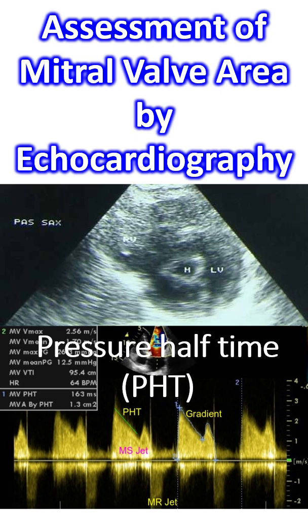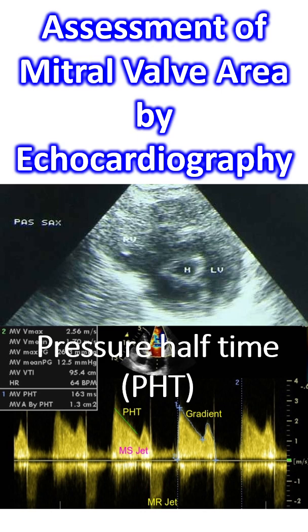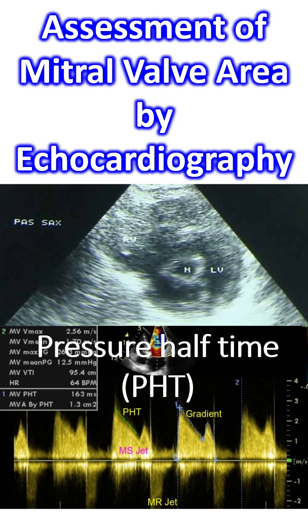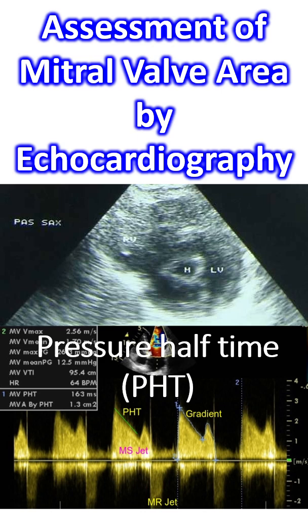The inner edge of the leaflets is traced in mid-diastole. Gain settings should be optimized, as high gain settings can underestimate the valve area.